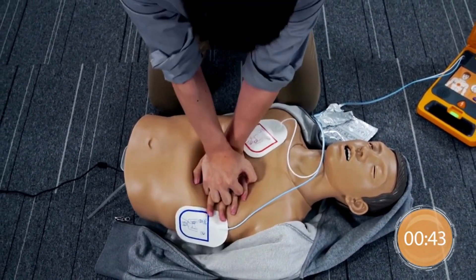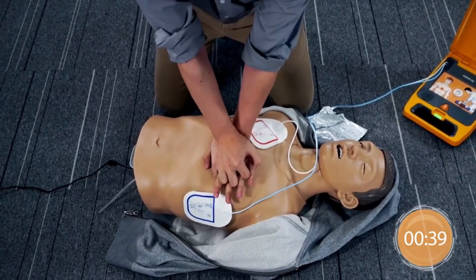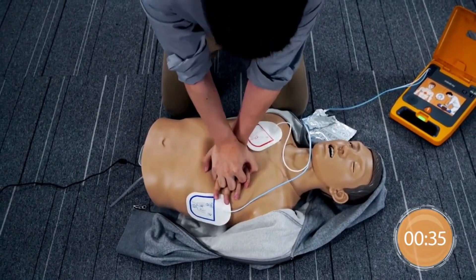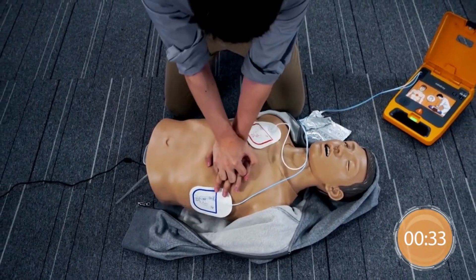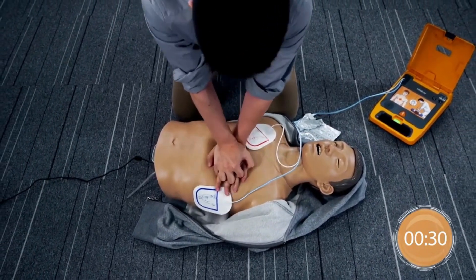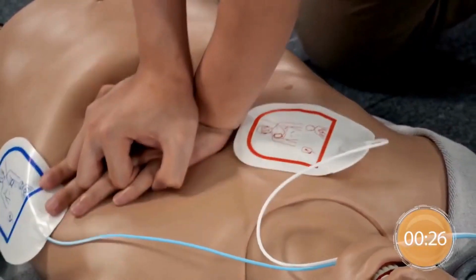Give chest compressions immediately. 50 compressions remaining.